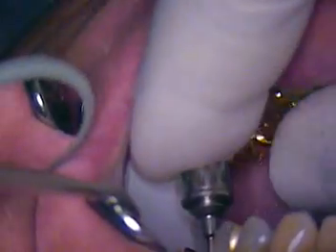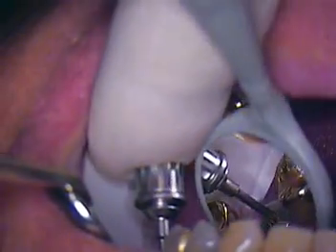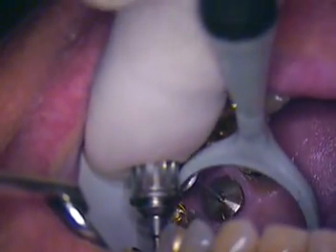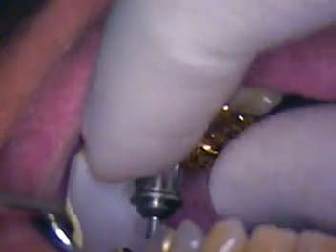Okay, so there we are. That's the angle of the implant. So you know it's going a little bit toward the distal. And that's why we're going to custom make this today. Alright, so now if we untwist that gently, out it should come.